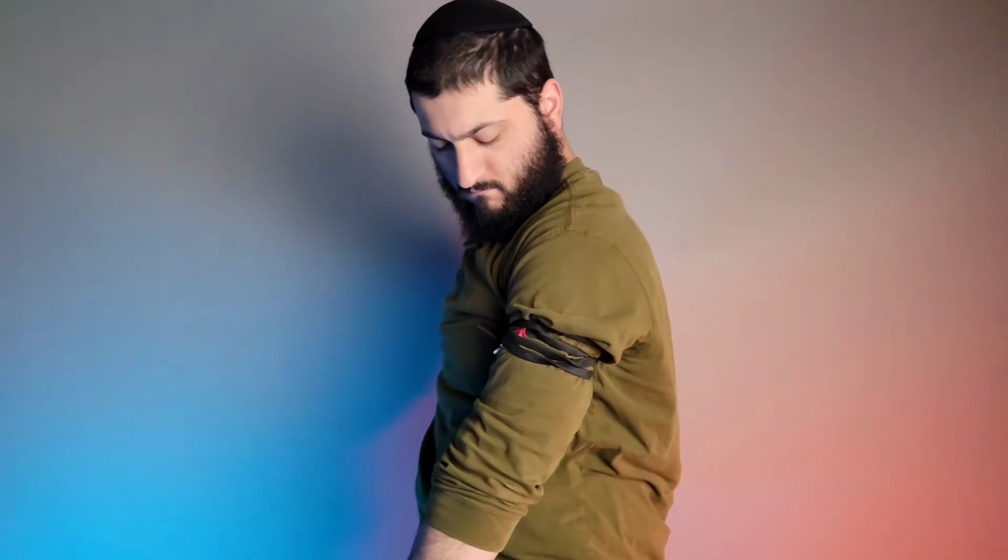But ultimately, the reason why a lot of people stopped carrying these is because people said that it was kind of lacking in regards to functionality. So you were giving up proper functionality of what a tourniquet is supposed to be, and ease of use and application, for the size.